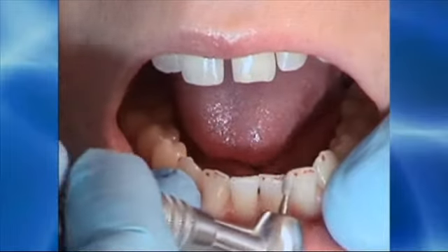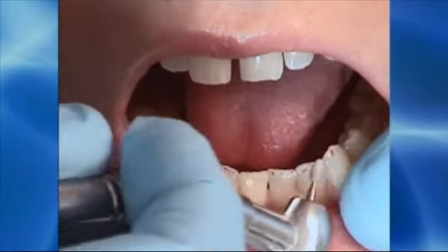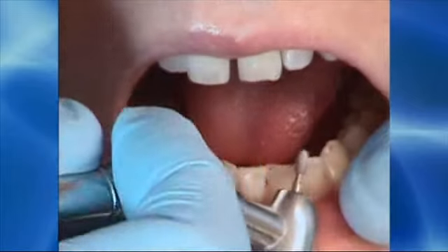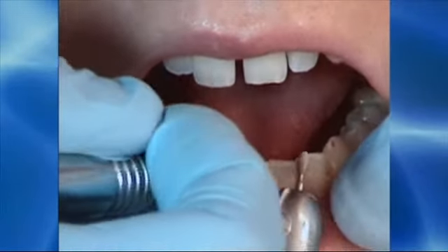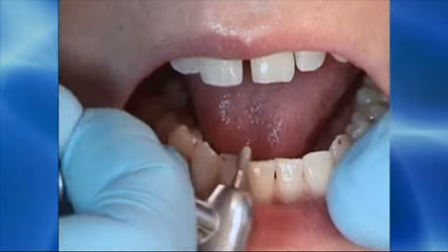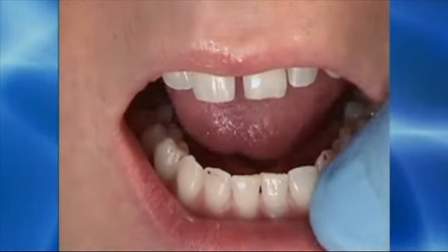Here I'm going to plane back the incisal edge, not shorten the tooth, but cant the facial aspect of the incisal edge towards the incisal lingual so that there is still contact but less surface engagement of the lower anterior teeth against the back of the upper anterior teeth.